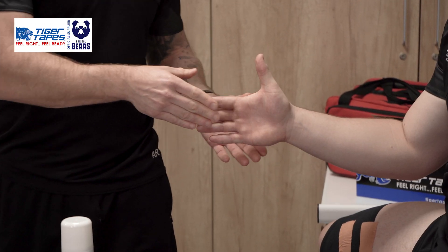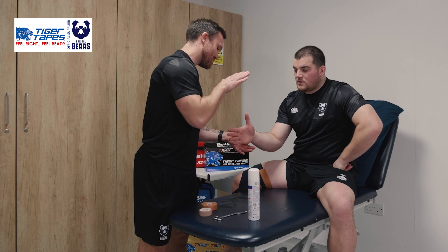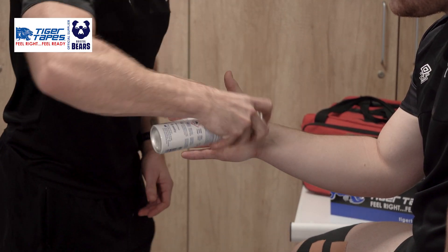Next up with George, we're going to strap his thumb for a thumb sprain. Very, very common in rugby with guys hitting rucks or getting a staved thumb. So to start, applying our pre-tape spray all across that thumb like so.